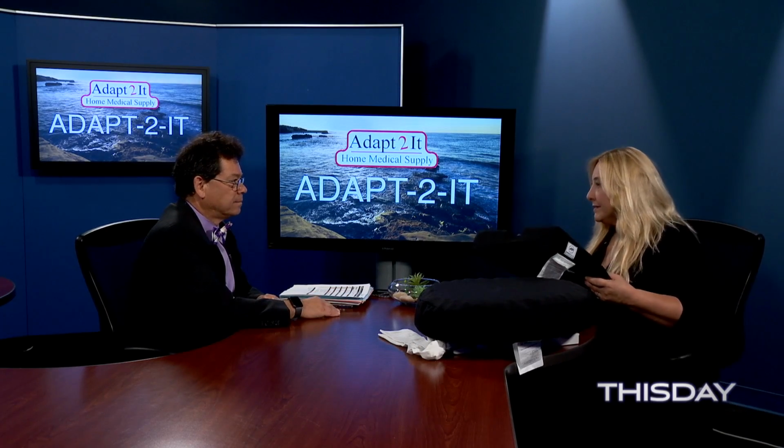So anyway, this one is for that, and other things. And then this one is for your tailbone. So this is a coccyx cushion. Tailbone is your coccyx, fancy name for it. And you sit on it this way. So you sit on it back, your tush goes here, your legs go there. And this one is actually made for the car.